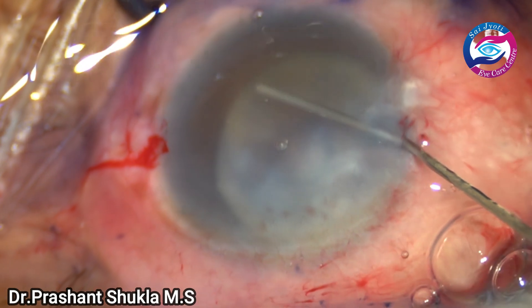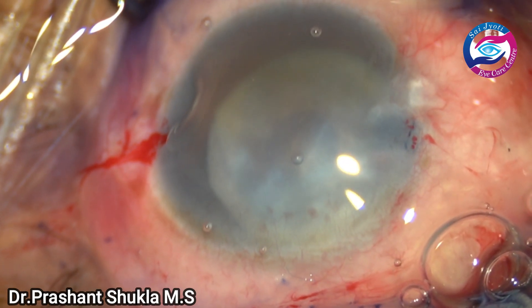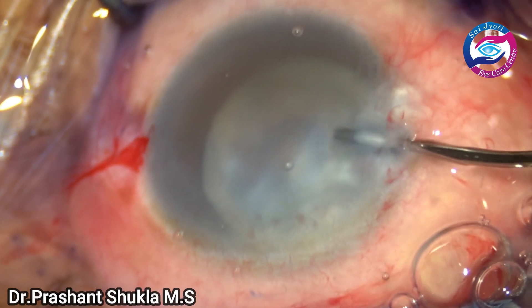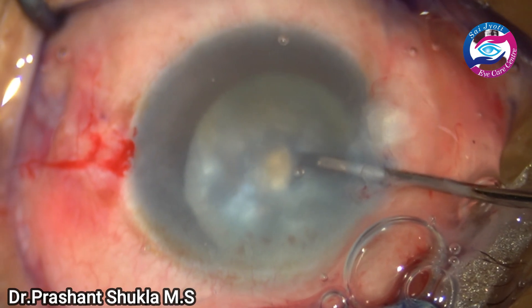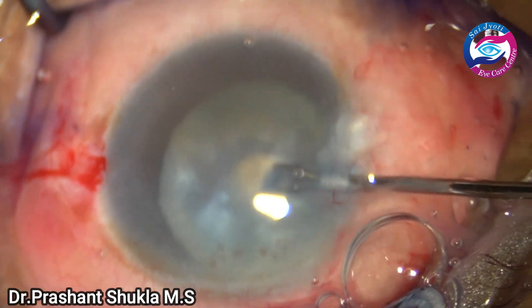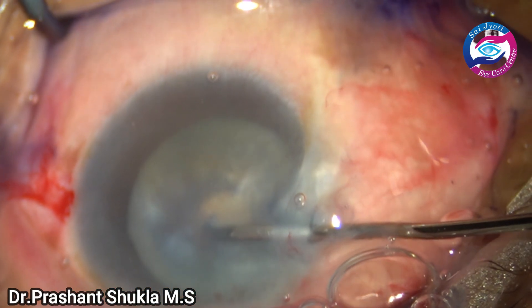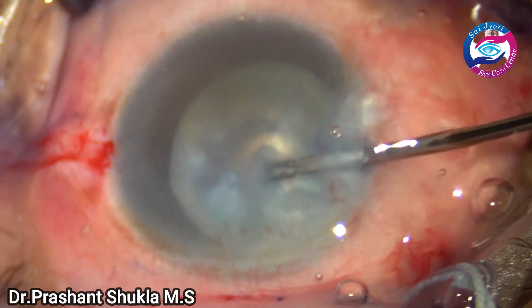Putting some more high molecular weight viscoelastic, and now I am going to take a micro rhexis forceps to make a small mini rhexis — grabbing the anterior capsular flap. Gradually and slowly the flap is being moved, and I am aiming to have a small rhexis of about 2.5 to 3 millimeters.